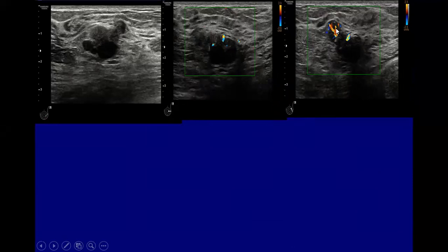So we are dealing with a vascular malignancy. Is it malignant? Are you sure it is malignant? We can say suspicious. Yes, great. But in the cystic part I could not see any vascularity at least. That means it is probably still a complex lesion.